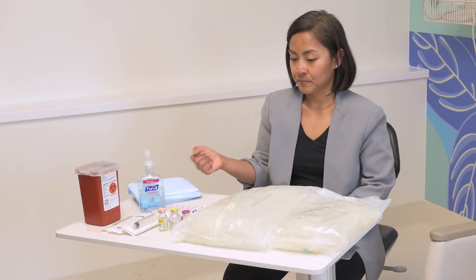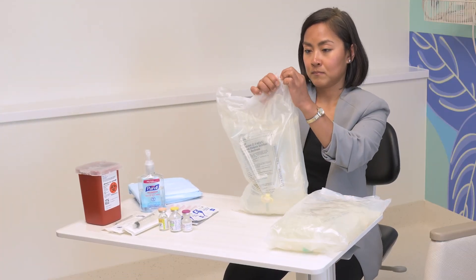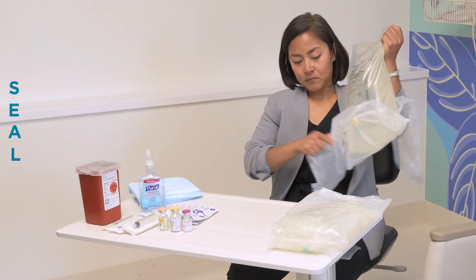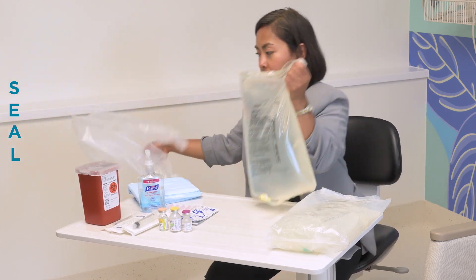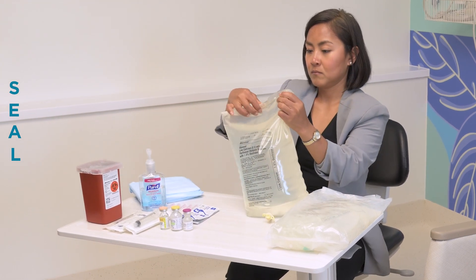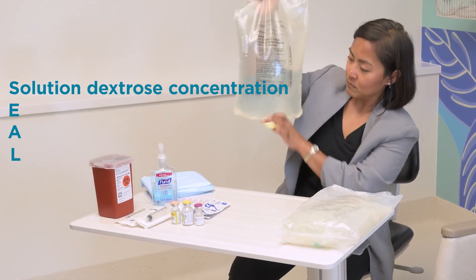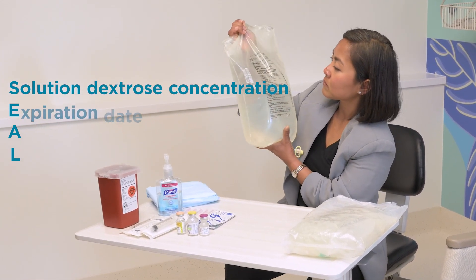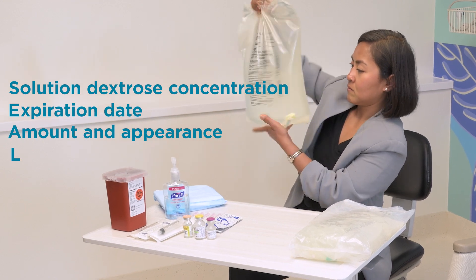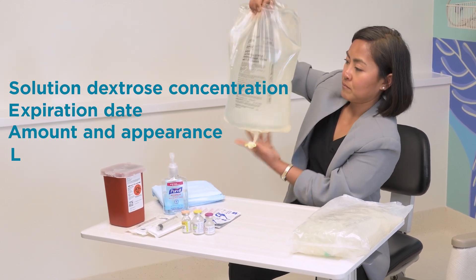Inspect the dialysate solution bags. Remember the acronym SEAL: check that the solution dextrose concentration is correct, the expiration date, the amount and appearance of the solution, and check for leaks.